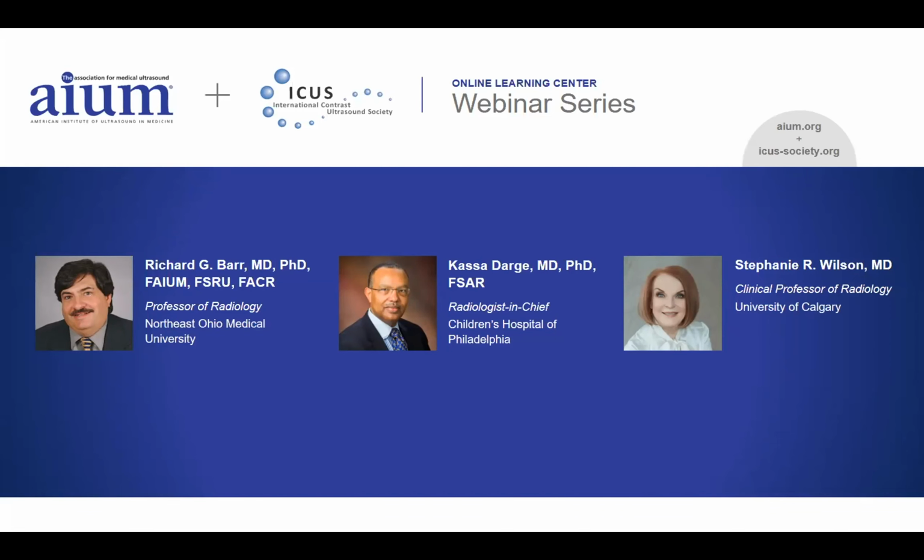So the first question that was asked was from Tucker MJ, who says, many years ago, Dr. Wilson came to the University of Iowa and assisted Dr. Abu Yusuf and myself with starting CEUS. I am curious, in Dr. Wilson and Dr. Barr's practices, obviously all of our practices, do they assist the sonographers with the CEUS exams, or do the sonographers do these without the assistance of the radiologists?